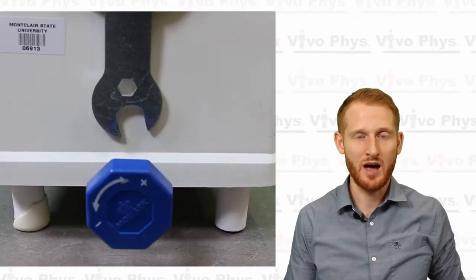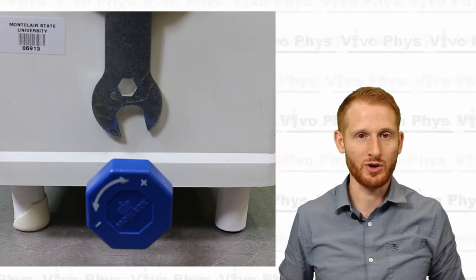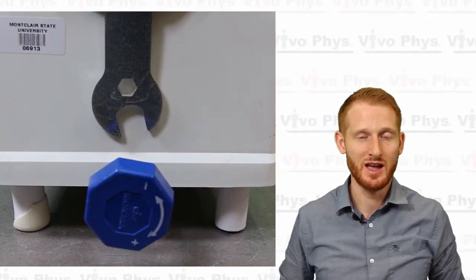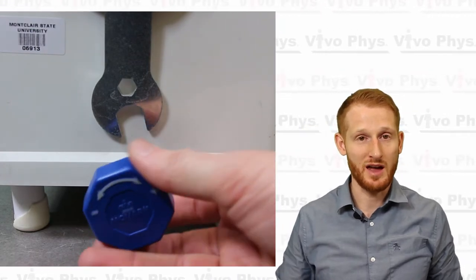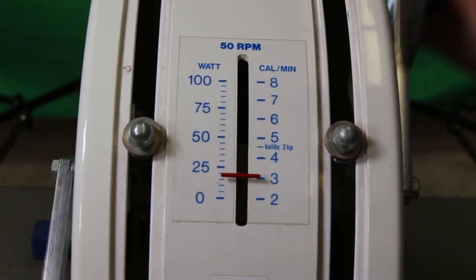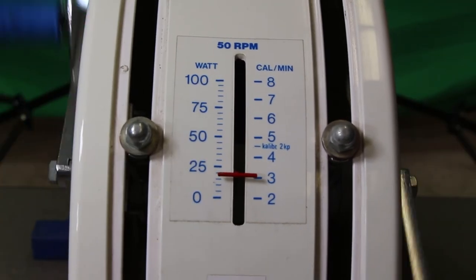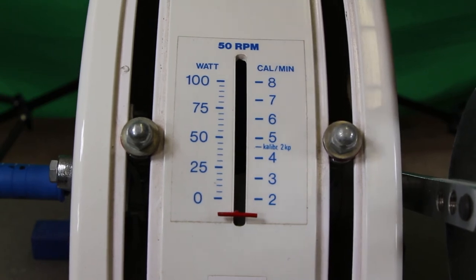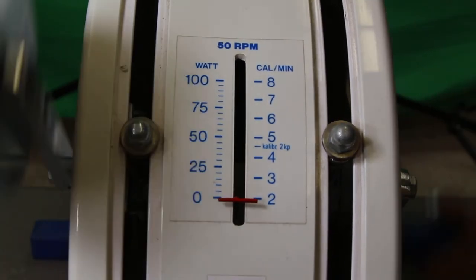In order to adjust the resistance of the exercise, there's a little knob on the bottom of the front of the arm ergometer. Turn it to the right to make it harder or left to make it easier. When you're doing this, you want to make sure that the person is actually pedaling while you're adjusting the resistance, or it's not going to show up on the resistance scale on the front of the device. The resistance scale only shows you the resistance if the person is actually pedaling.